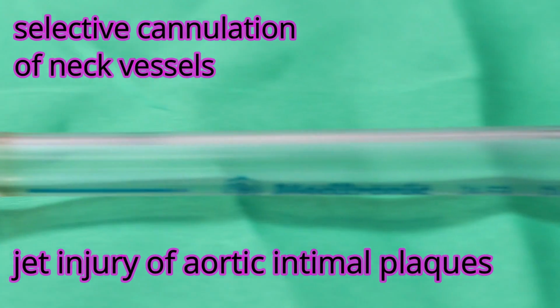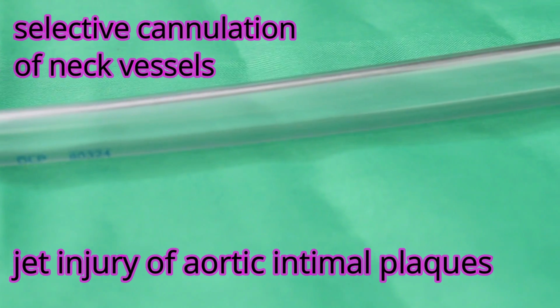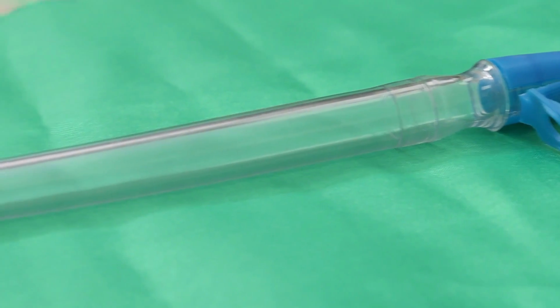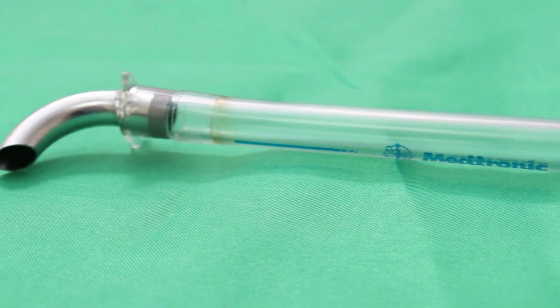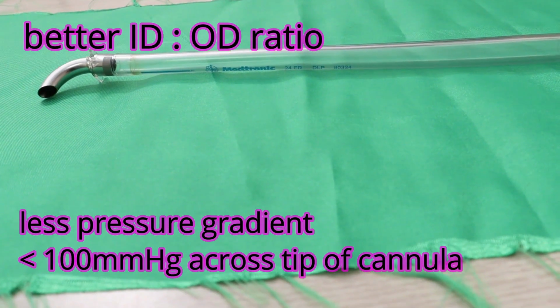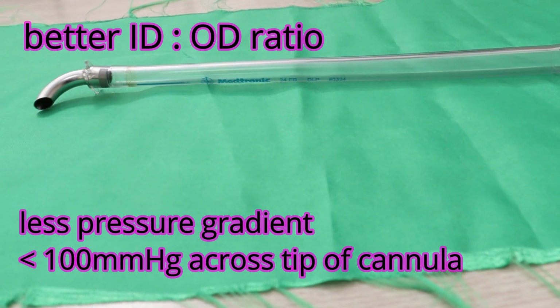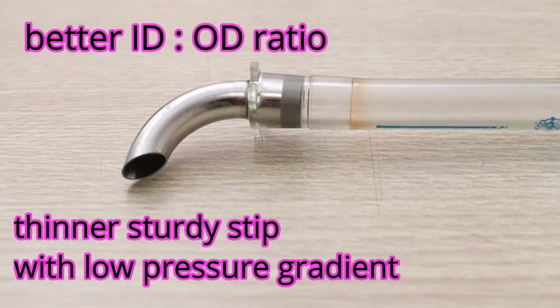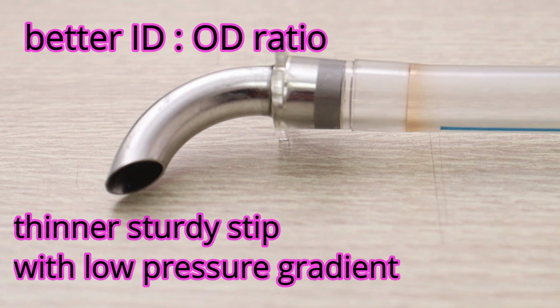If they are there at that point of hitting the aorta, it can selectively cannulate the neck vessels. If you tilt the cannula too much, it can give higher gradients, or the perfusionist may complain of obstruction to the aortic cannula. But the advantage is that it will not injure the posterior wall. A better ID/OD ratio, as you said before, will give rise to a lesser pressure gradient that is less than 100 millimeters of mercury. That is what we expect for all aortic cannulas at the tip of the cannula.